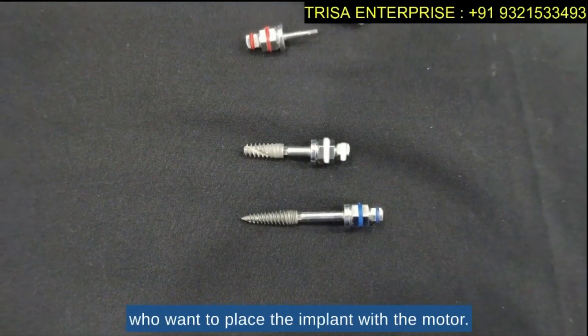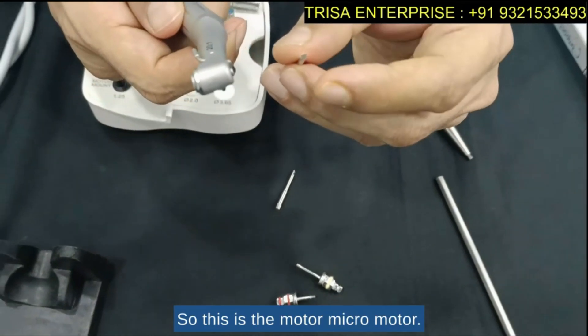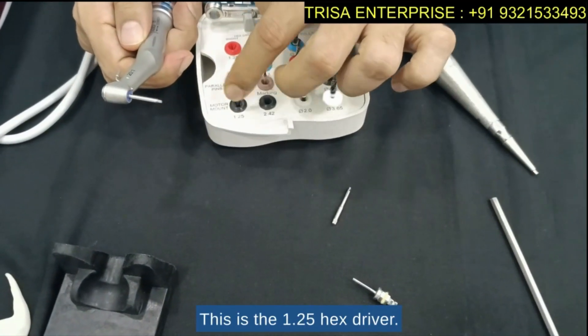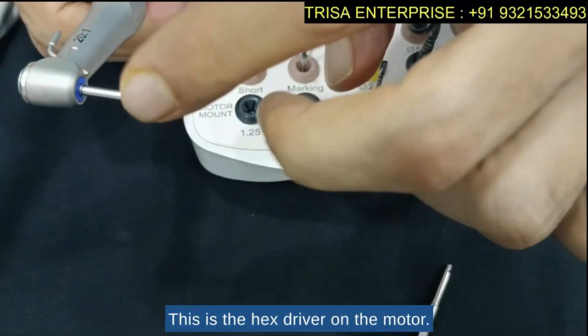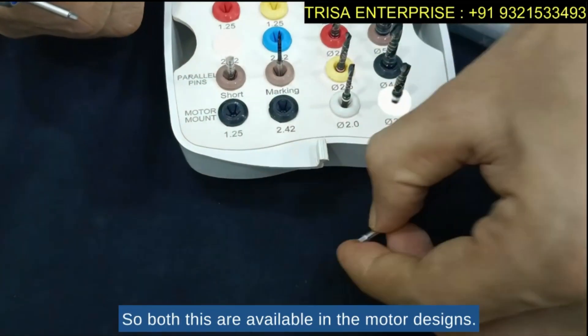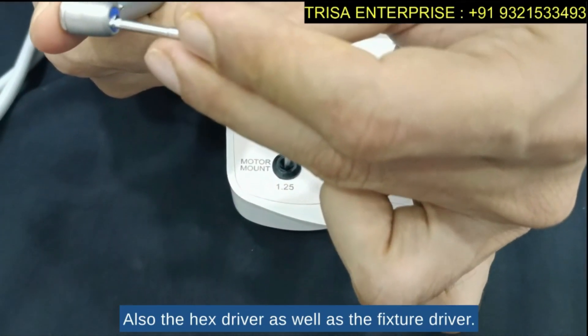For those who want to place the implant with a motor, we have a motor micro-motor design available. This is the 1.25 hex driver for the motor, and this is the fixture driver for the motor. Both the hex driver and the fixture driver are available in motor designs as well.